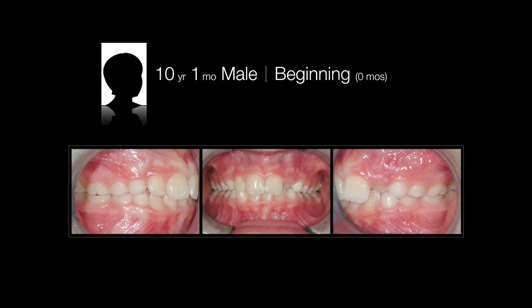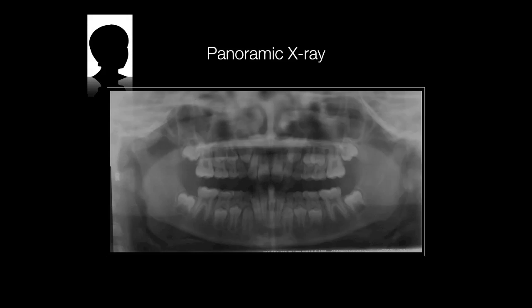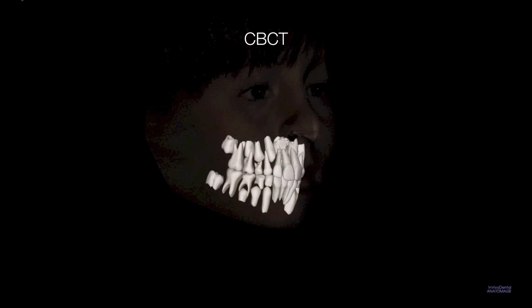The second case is also what most of us would specify as a routine case, simple crossbite of an upper left permanent lateral incisor. Many general dentists would actually treat this using a very small finger spring on a retainer. And here's the panoramic x-ray, which doesn't show too much regarding that left maxillary unerupted canine. But when you get in closer, you can see that it is tucked somewhere near that lateral incisor root, but we can't really tell how close.